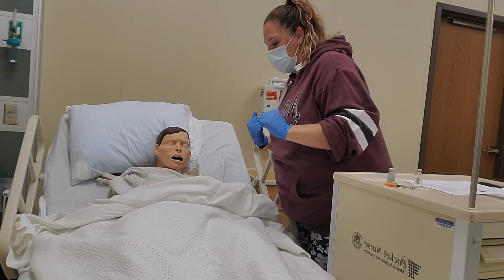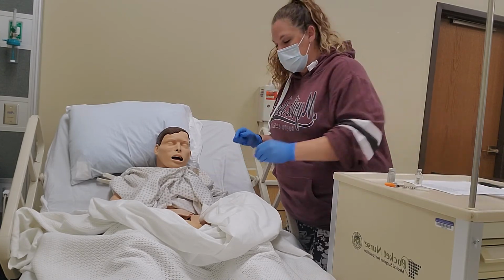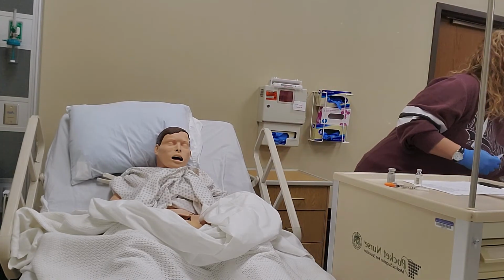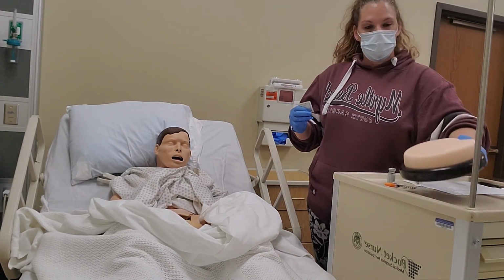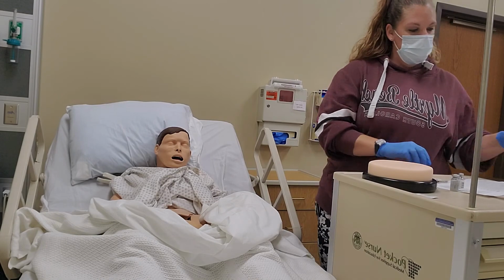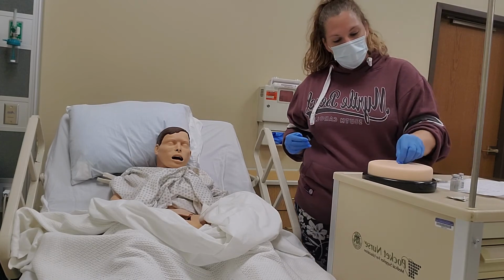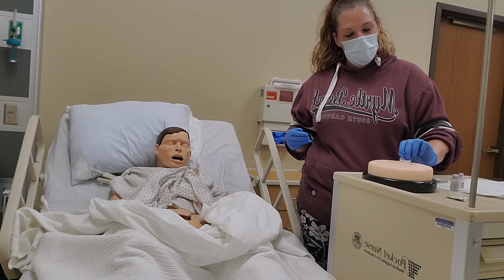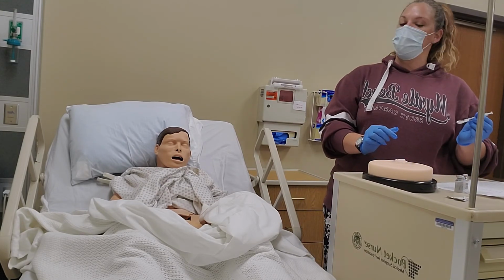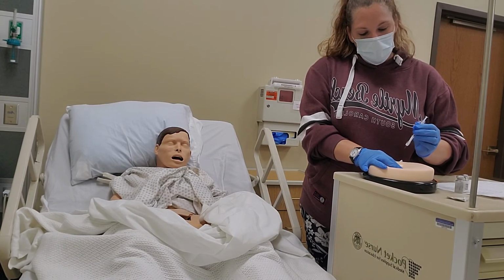Okay, Mr. Truman, is it okay if I pull up your gown? I'm gonna give it right here. So I will go ahead and take an alcohol swab, start in the middle and go out. Let it dry. For this, I'm gonna use the Injectipad. So, start in the middle and then go out. We're gonna let that dry. Okay. And of course we know that this doesn't dry very well, so I'm gonna go ahead and just pinch the skin a little bit.